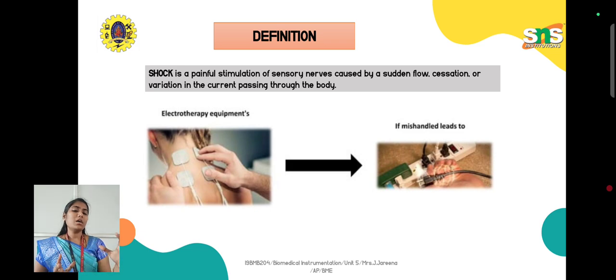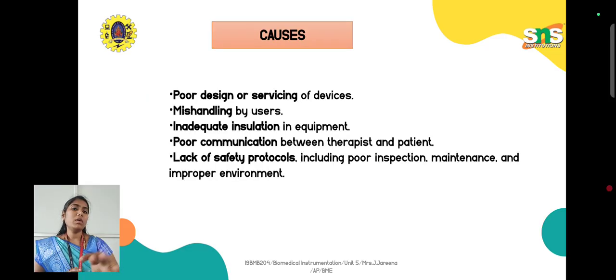You can see this kind of shock everywhere the power supply is used without proper installation, proper coverings, or proper earthing. But on the medical side, we have to be very careful and conscious when we are using a medical device. We have to check it thoroughly before using it on the patient, because any minute leakage or any minute problem will lead to a flow of current into the patient's body, and then it will disturb, as I said before, the total mechanism. It will shut down all the mechanisms, and the person's life will become miserable. So that is the main thing we have to be very serious about.